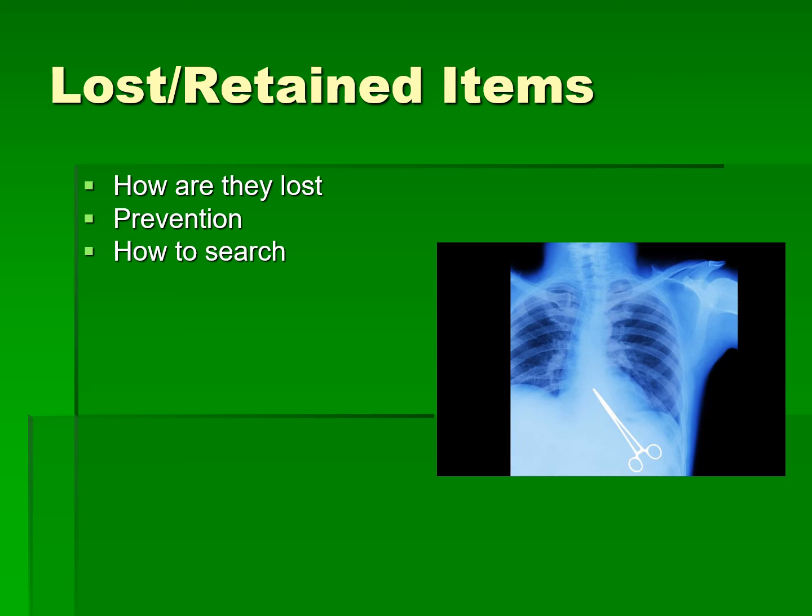Keep all of your little sharps together like they're little ducklings. They want to be together. When you're not otherwise engaged in the procedure, do a quick count intraoperatively, just a mental check of things. All right, stay organized. The more organized you are, the better. Okay.